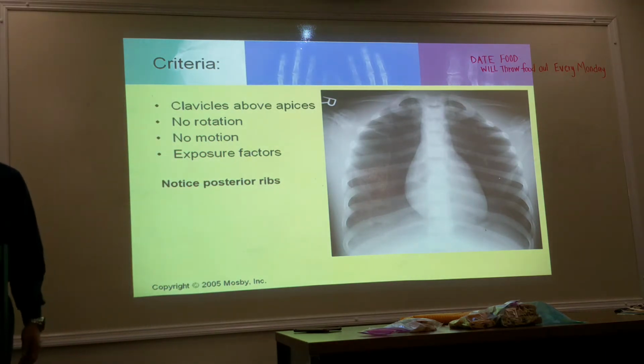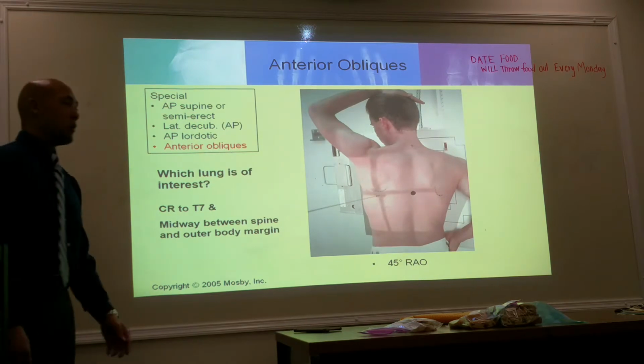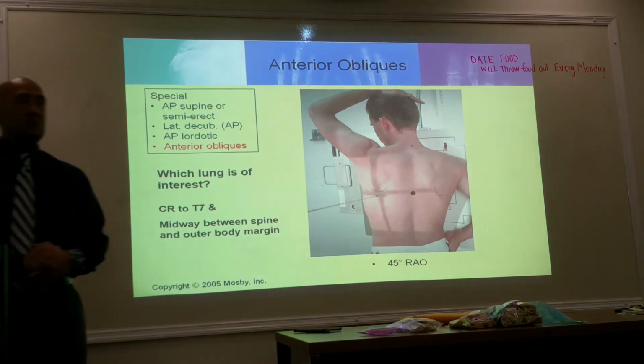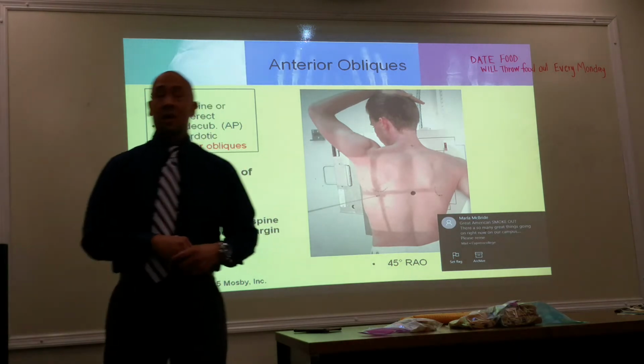All right, let's talk about obliques. The whole purpose of the oblique is to evaluate one of the lungs.